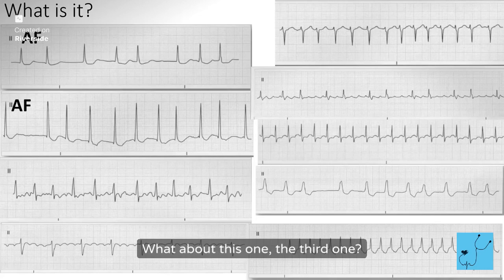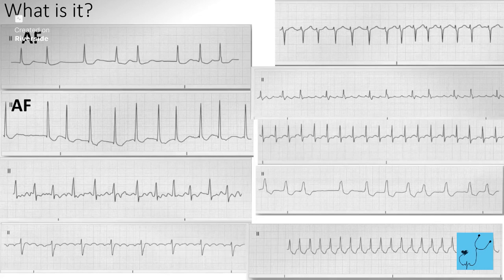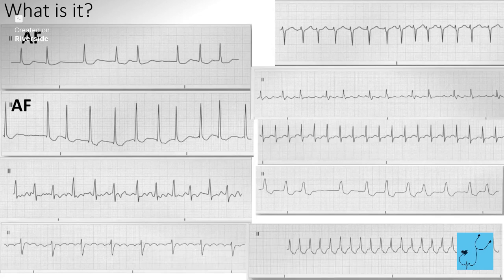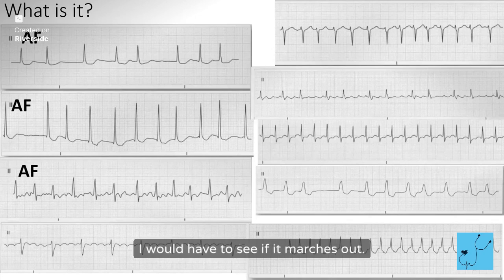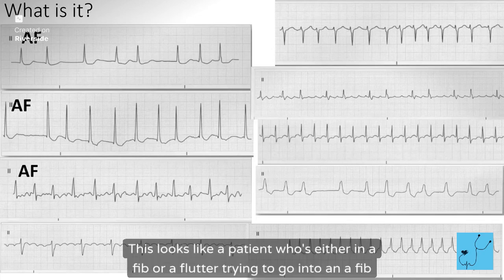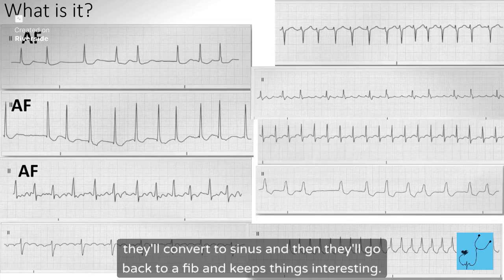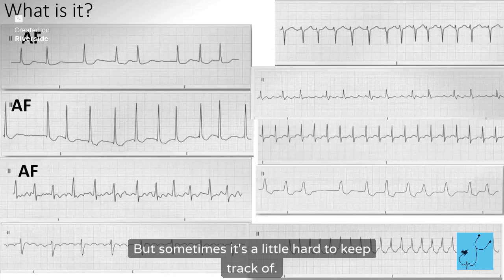What about the third one? If you're not sure, you want to break it down into like one complex. That helps sometimes too. Yeah, it kind of looks like a flutter. I would have to see if it marches out. This looks like a patient who's either in AFib or a flutter trying to go into an AFib or a flutter. And some patients will do that with sinus rhythm. They'll be in AFib, and then they'll convert to sinus, and then they'll go back to AFib, and keeps things interesting. But sometimes it's a little hard to keep track of.